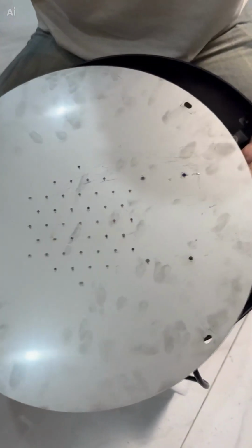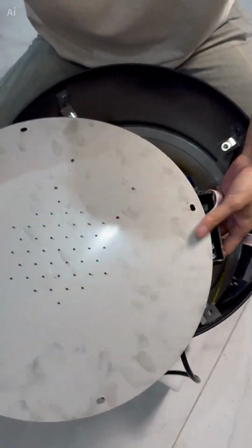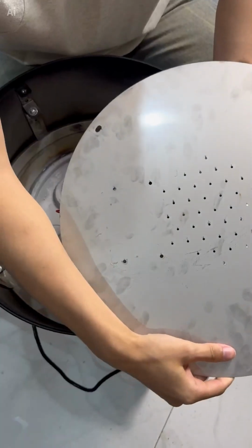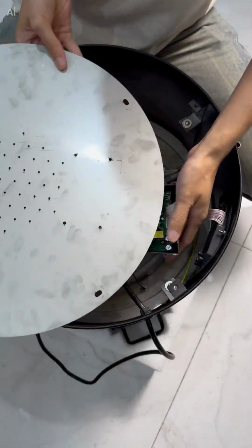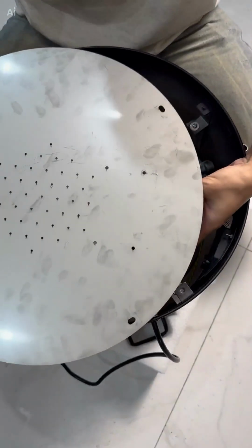Then, when aligning here, be aware that this base has 2 directions. One is this direction. It can be locked like this, and it can also be locked like this. We need to use this side. Use this direction to lock the circuit board.